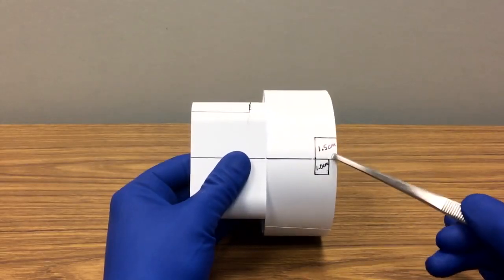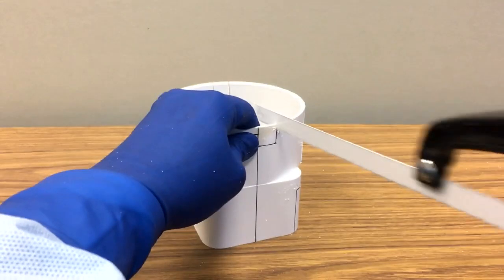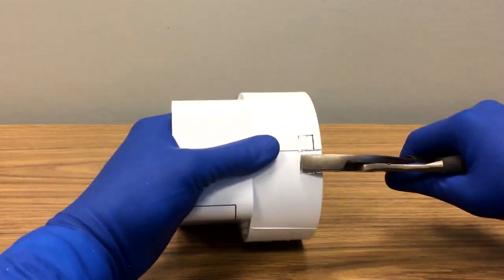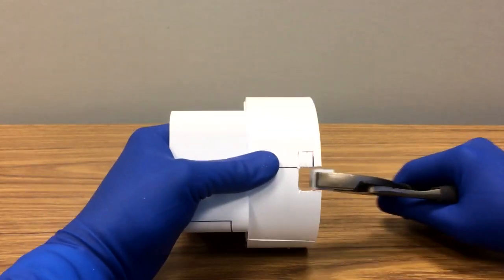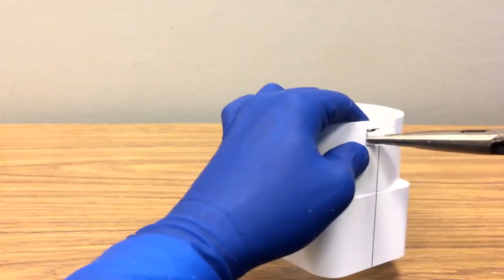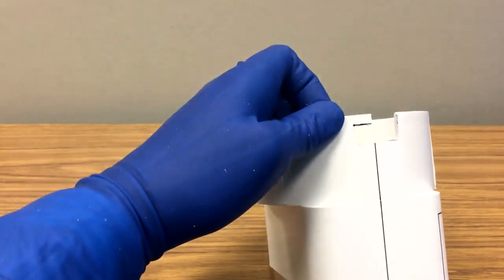1.5 and 1 centimeter squares are marked out. The 1.5 centimeter square is removed using a close quarter hacksaw to make the cuts and a pliers to gently pry the square out. The 1 centimeter square is cut in a similar fashion and pried out with the needle nose pliers. The cutout is repeated on the other side.